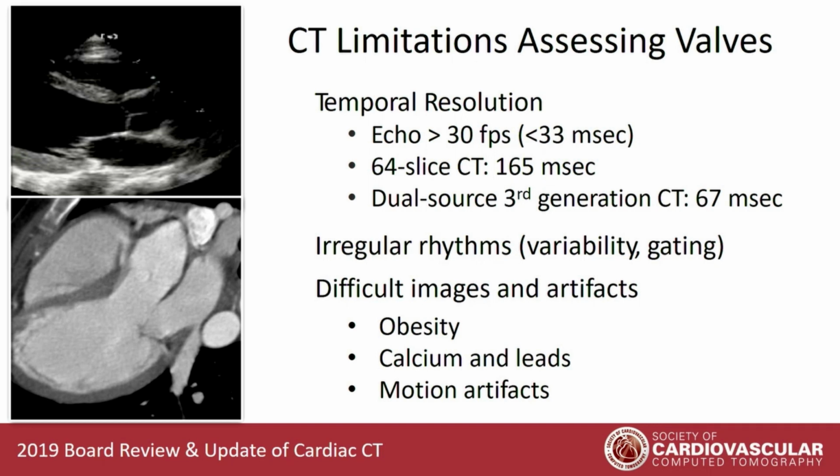With regard to irregular rhythms, what does an echo care? If you've got an irregular rhythm, it might be a little tough to see, but most of the time, honestly, you're going to be able to follow with sound waves. But irregular rhythms, issues with variability of heart rate, issues with cardiac gating, right? These are a real bugaboo for us in CT.